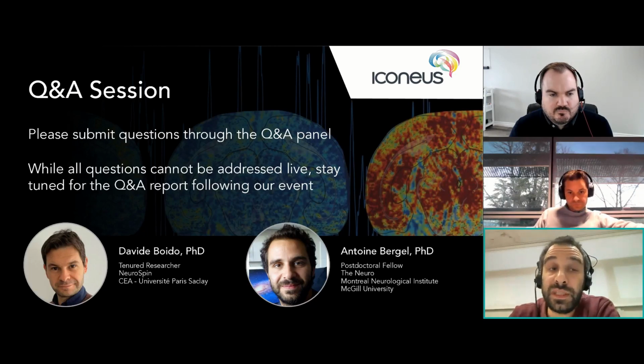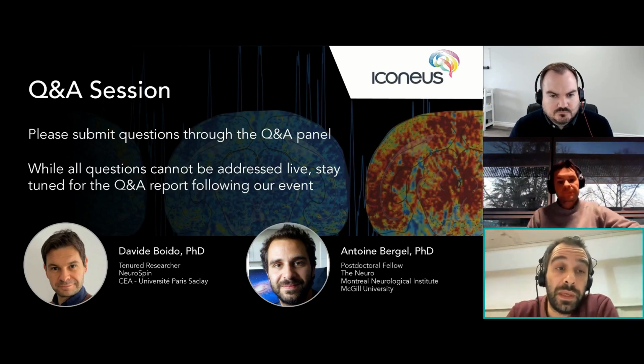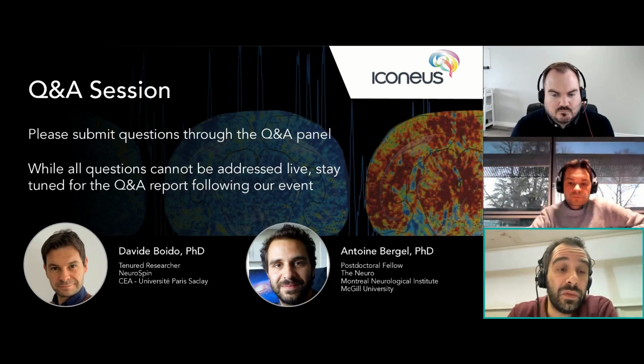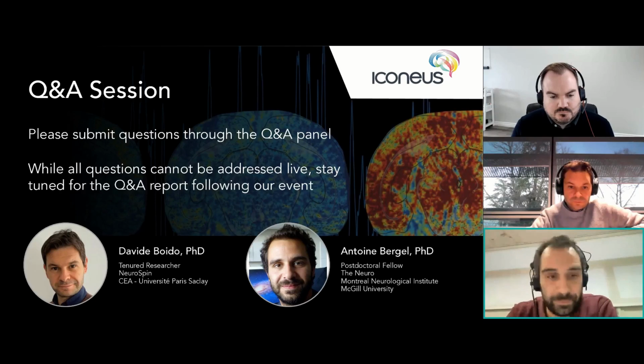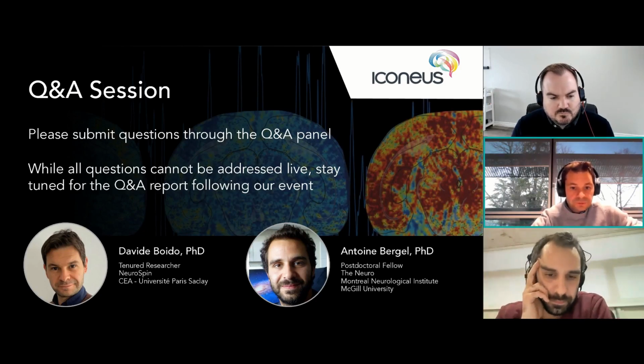We can also investigate movement of bigger structures, especially the movement of the choroid plexus, which is also currently under investigation. So I don't see any reason not to see them if they're not too small. And if I can complete, there is also this new high-resolution functional ultrasound that was just introduced last year by the group of Michael Tanter. So probably with that approach, we will get chances to look at what you want to look at.